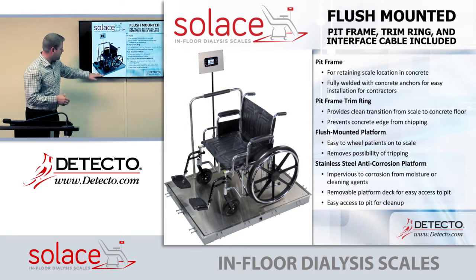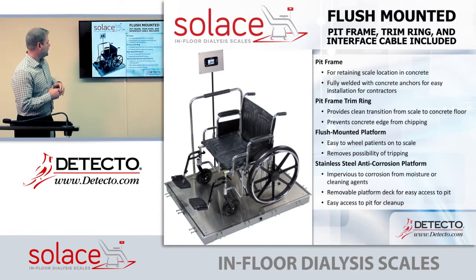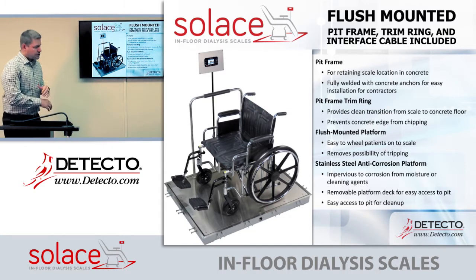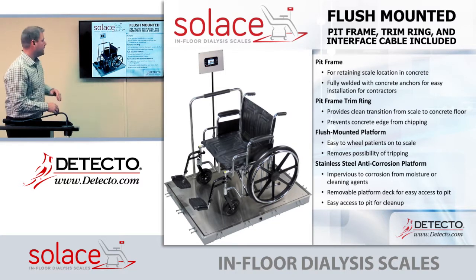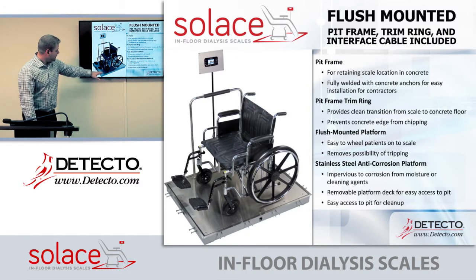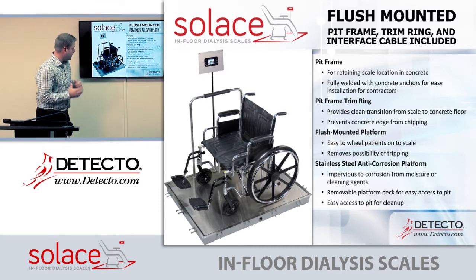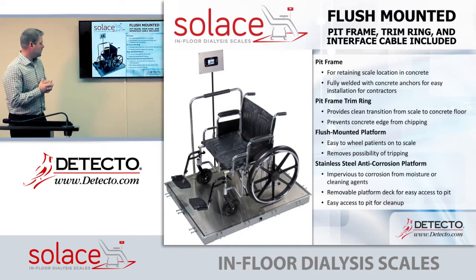Everything is flush mounted, making it very easy to wheel patients on and off in a chair and removing any possibility of tripping. The stainless steel top is impervious to corrosion and all cleaning agents that hospitals or dialysis centers might use. Another benefit is that you can remove the deck — there are screws around the perimeter of the platform — so if there's a spill, such as a blood spill or cleaning agents, you can simply use an Allen head bolt to remove the deck and clean the pit without removing the entire scale.